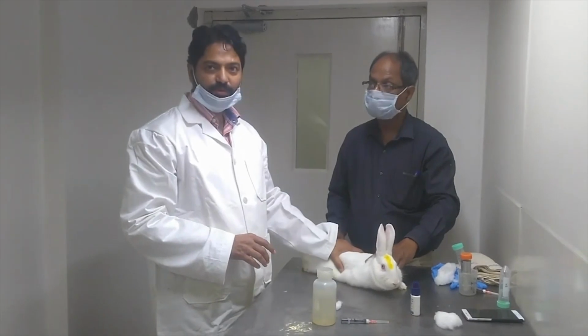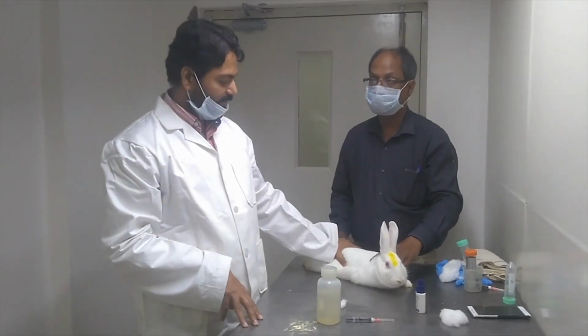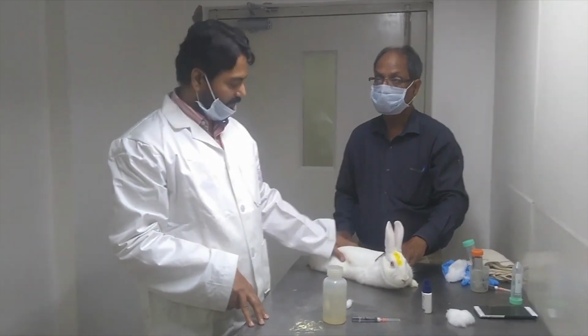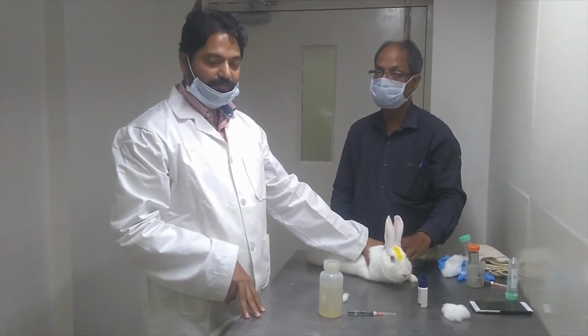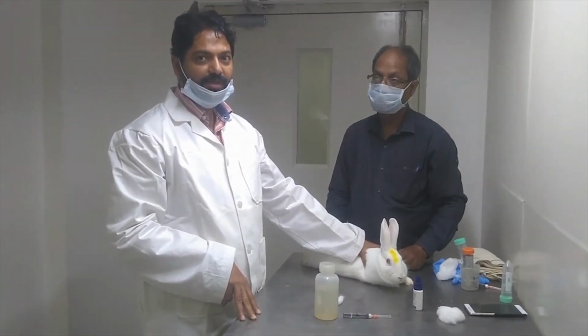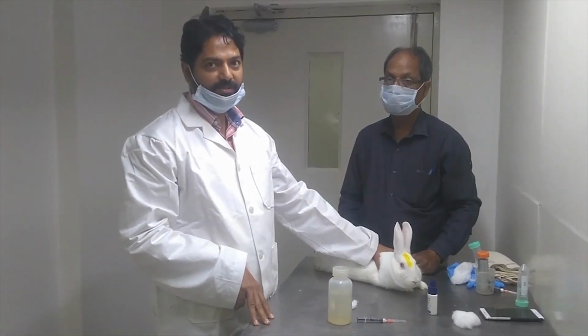The first and important thing in all these animal processes is that we have to avoid pain to the animal. For that purpose, we have to restrain the animal because we have to inject. So we restrain the animal in a way that it has less and less pain, and the movement is also less.